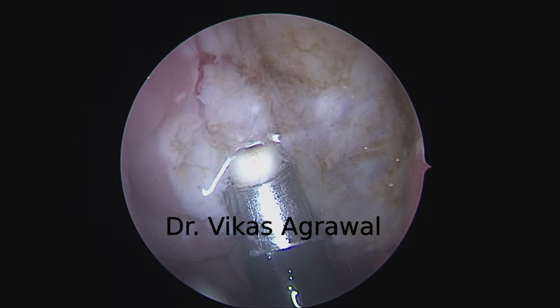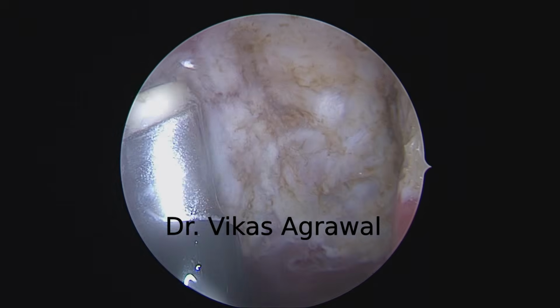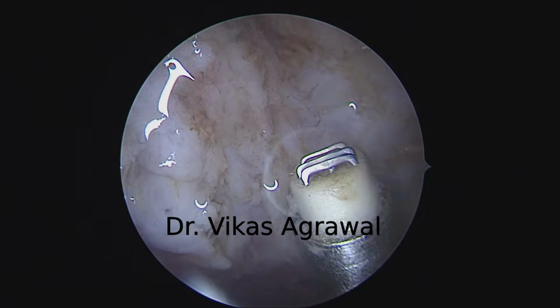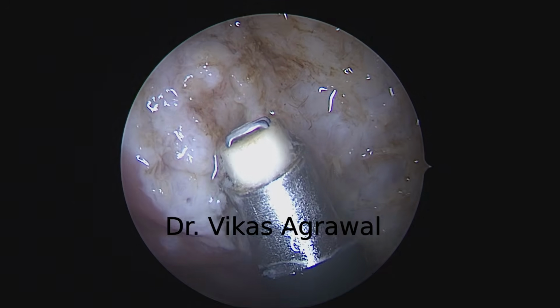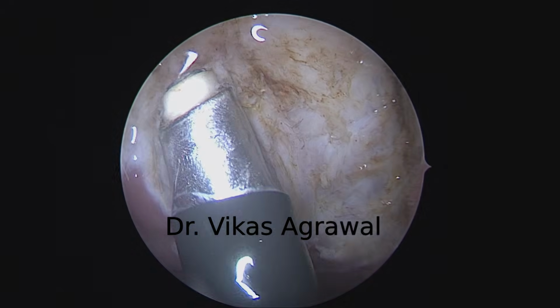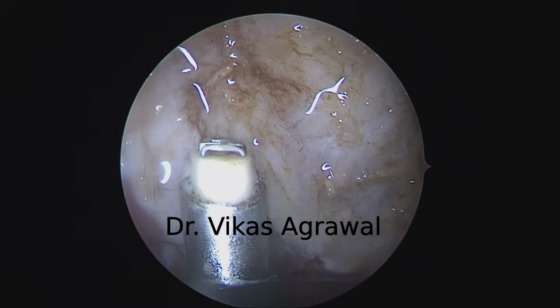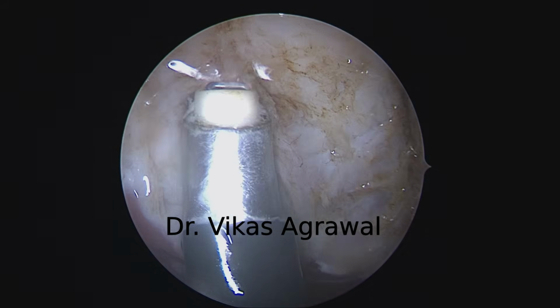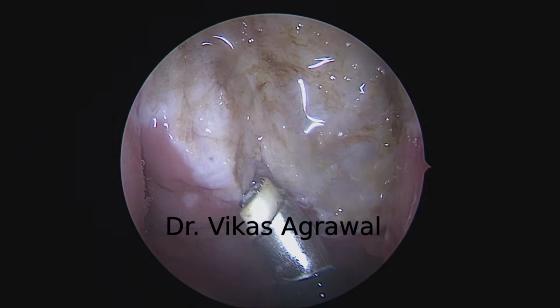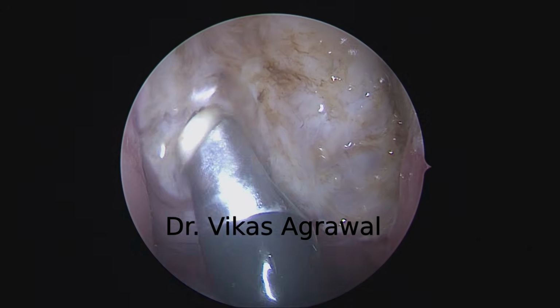Whatever I can see very clearly, that's the midline. A lot of tissue was pending in the midline. If your scope is fogged, you can just clean it on the tissues, or you can put some saline. It's important to remove tissues till the boundaries. Otherwise, your surgery remains incomplete. And at the same time, you should never cross the boundary, or then your complications start.